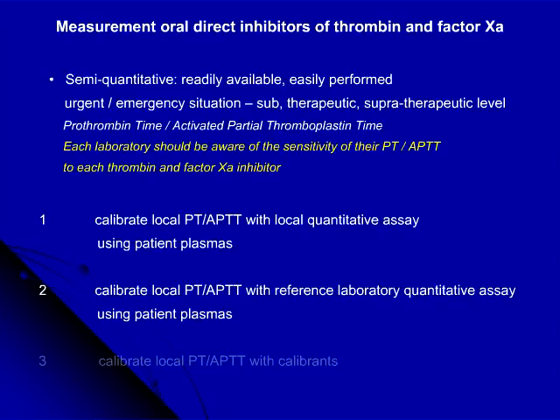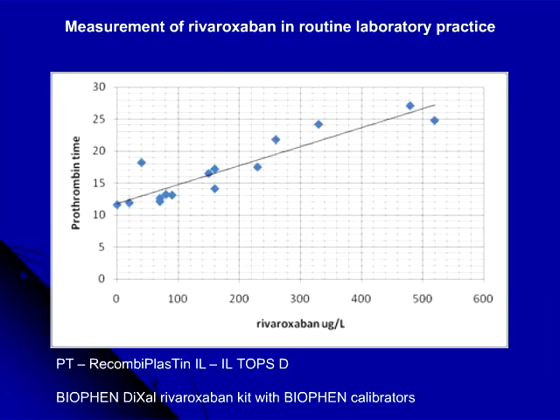And a third way to do this would be to use actual calibrants, but there are potential problems with calibrants, and it would be essential to ensure that those calibrants are fit for purpose in that context. So here's a simple way of doing it.